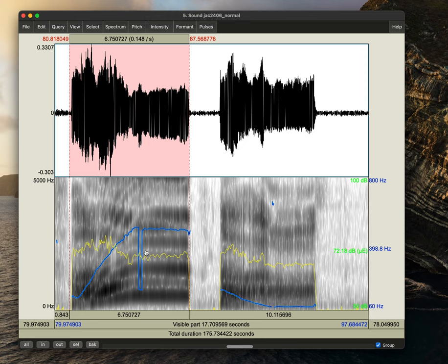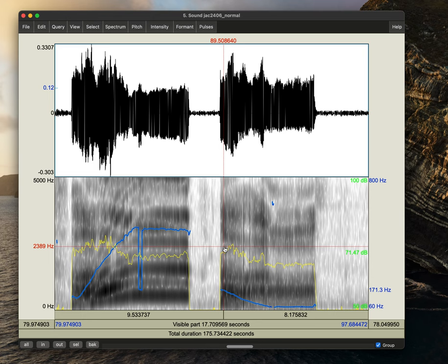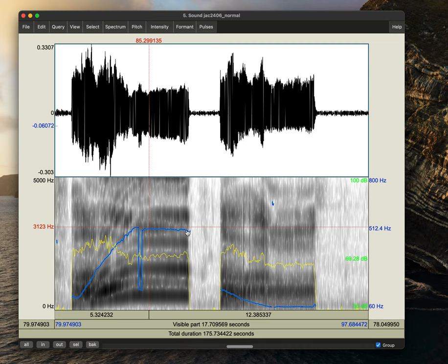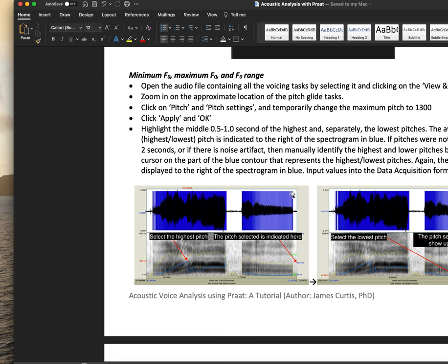Let me verify. We can already see that this looks like it's probably the pitch task, but let me just verify. OK, so we can see that there's a little bit of noise artifact because of a pitch break. So we'll want to account for the fact that this probably isn't the true pitch here. Let's verify that it's the descending pitch glide. Great. And so for both of these tasks, we can see that the highest and lowest pitches were sustained for about two to three seconds, which is what's recommended.